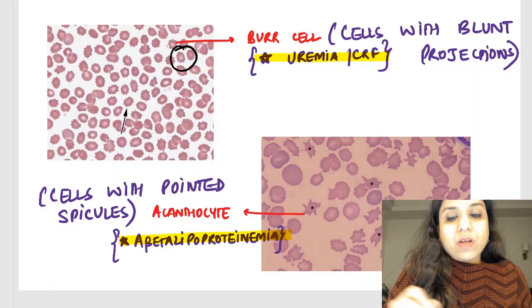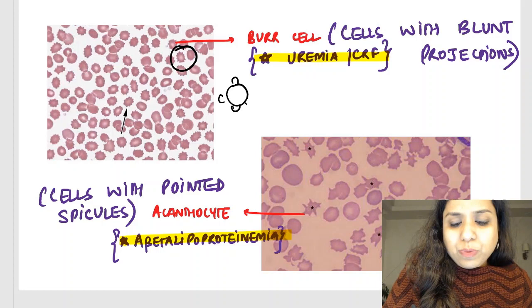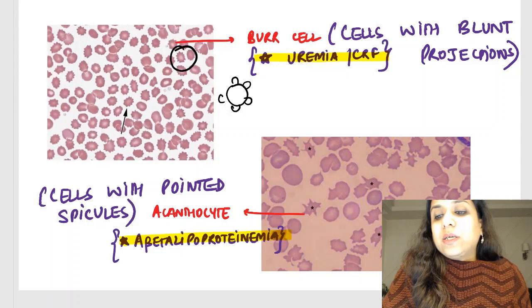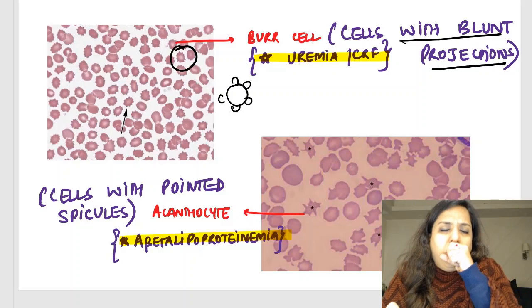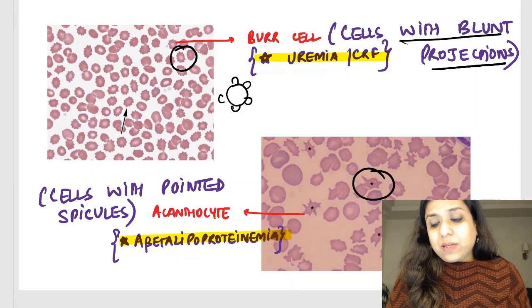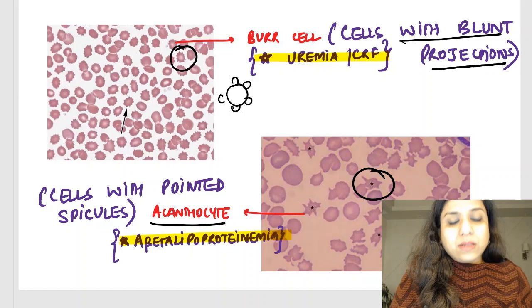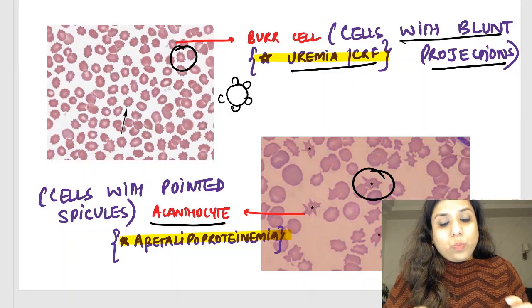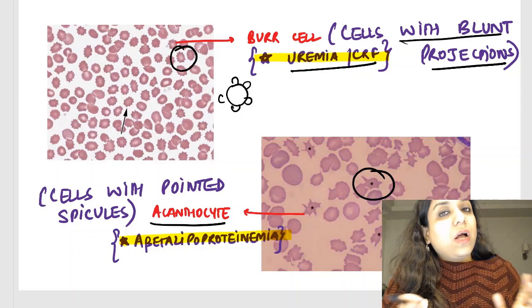In this image, can you see these cells? The RBC has got blunt projections — that is called a burr cell. In contrast, here the RBC has got pointed projections — that is called an acanthocyte. Burr cells are seen in uremia or chronic renal failure, whereas acanthocytes are a characteristic feature of abetalipoproteinemia. These are one-liners which are usually asked.